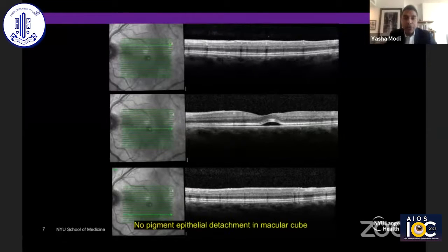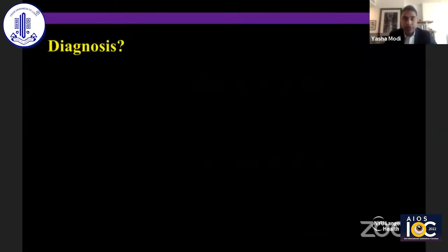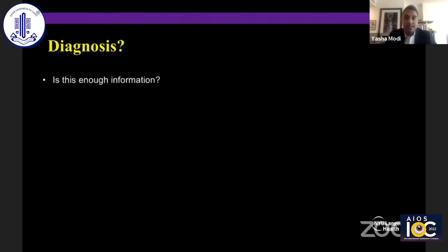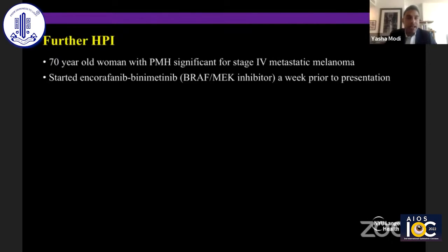Notably, there's no pigment epithelial detachment in the macular cube. I'd ask the audience to think for a moment: is there a particular diagnosis in your mind at this point, and is this enough information? For the sake of time, I'll move on and tell you that this patient has a past medical history significant for stage four metastatic melanoma.